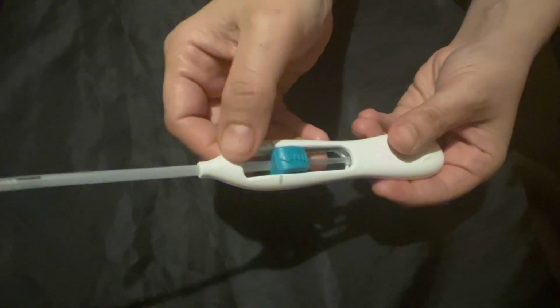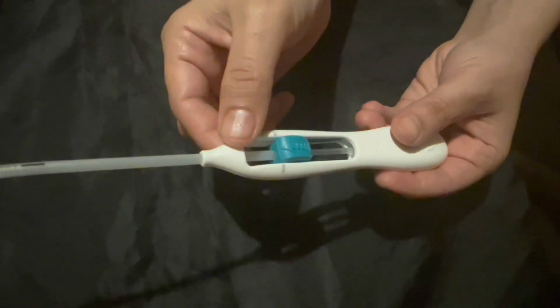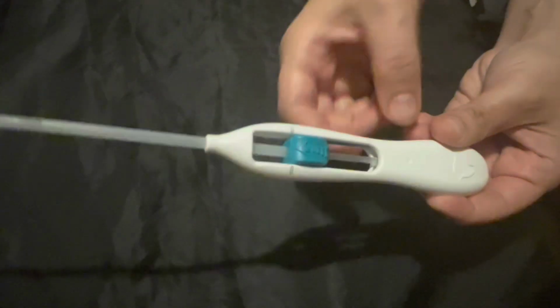That is how we insert the coil. If you push it forward to this point, this brings the arms inside this tube. If you move this slider backward to here, that releases the whole coil outside the tube. Previously there were threads coming from this point, but there are no more in the new version.